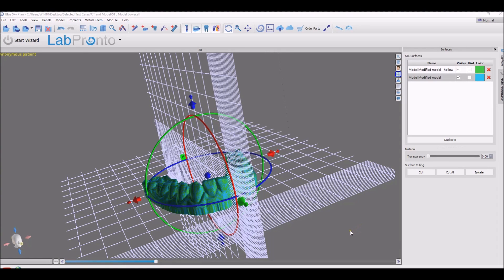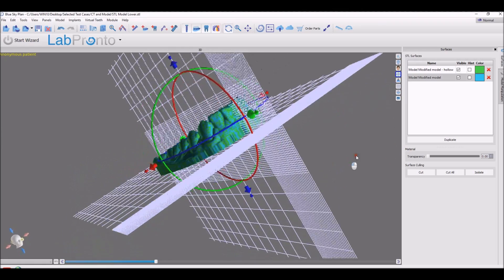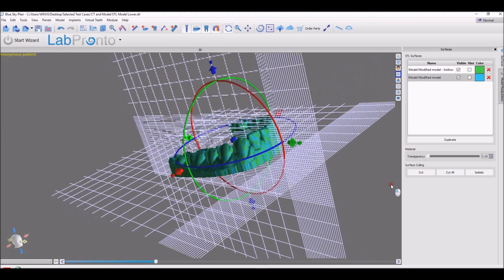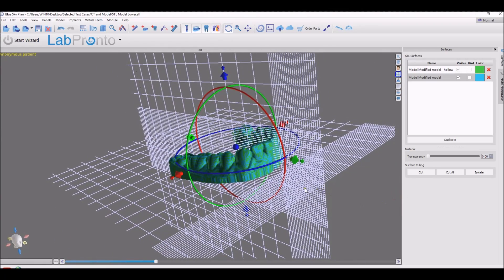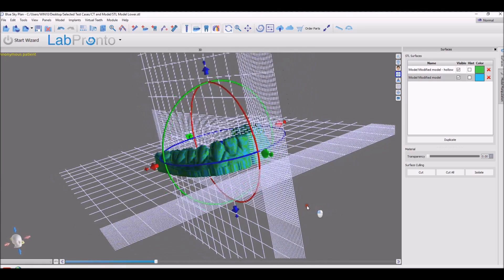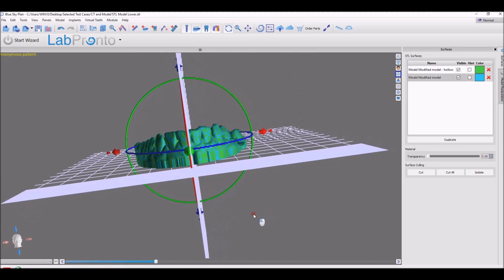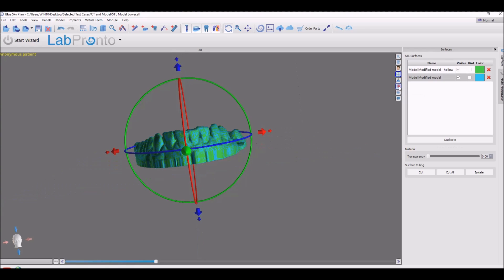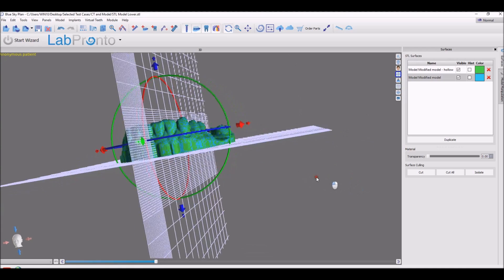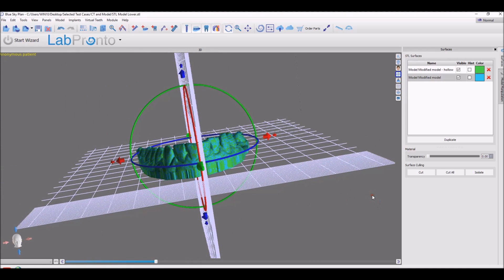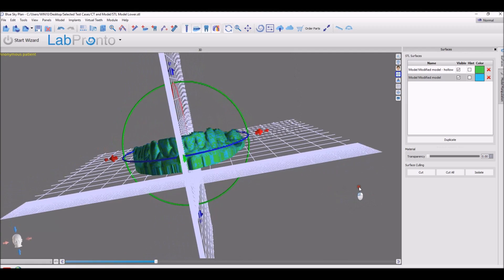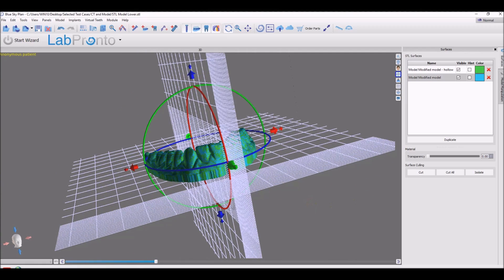The first addition to the software is the grid that we see on the screen. Some of the lines have a 1mm separation and others have 10mm separations. That can be changed in the default settings. In options, you could toggle the grid on and off by the grid visibility box on the right side of the screen. It's great to use when aligning models and in the denture module when you're placing teeth.